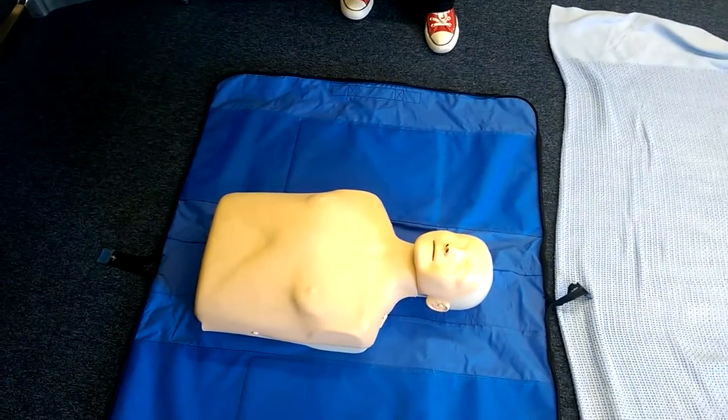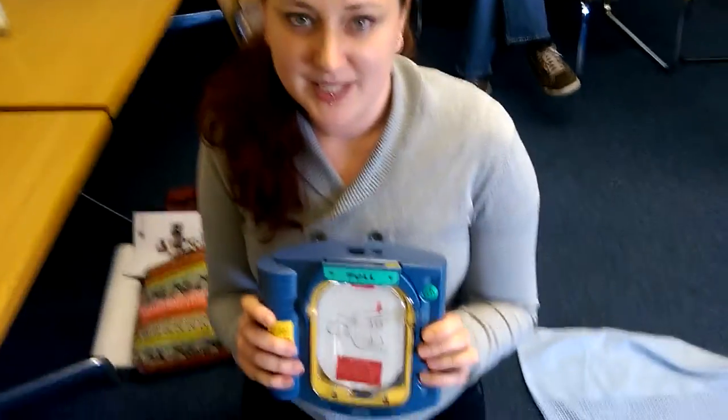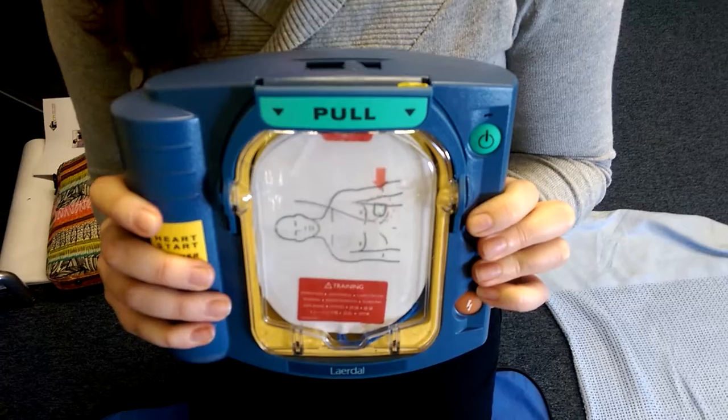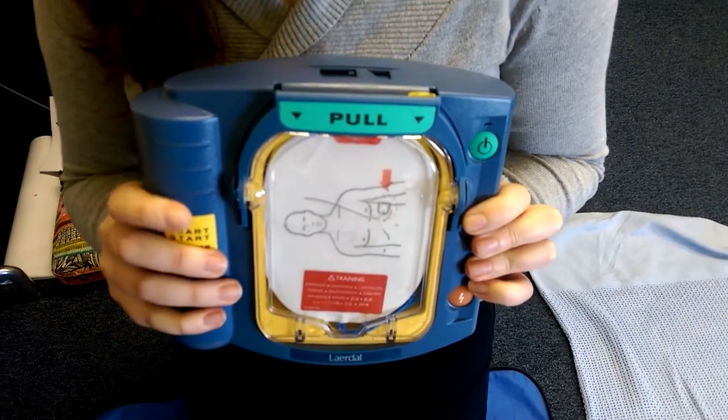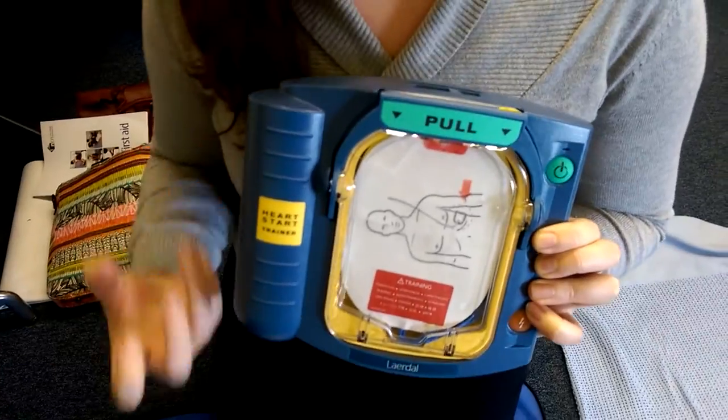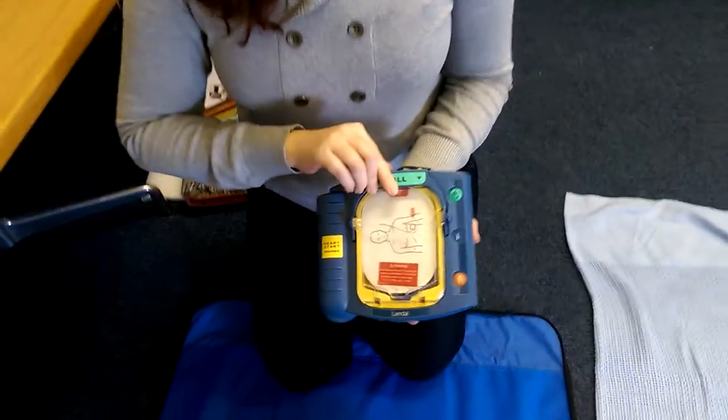Here I've got a lovely automated defibrillator unit, and this is going to give our patient a shock so their heartbeat will hopefully go back to a regular rhythm. This uses electronic sensors which will administer the correct current. It's all automated, so as soon as you open it up it's going to start talking.